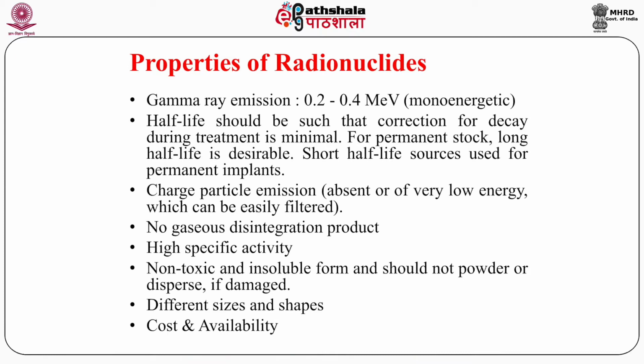No gaseous disintegration product. There should be no byproduct of any gas, because in older days radium needles were used. Its byproduct was radon gas, and radon is very dangerous in the sense it is again radioactive, and if somebody inhales that radon, this radon is an alpha emitter.